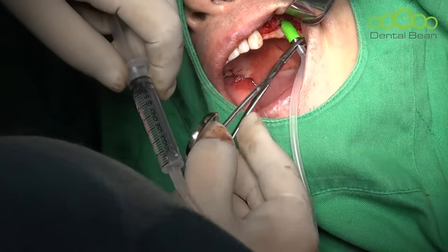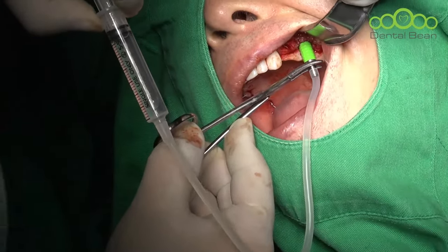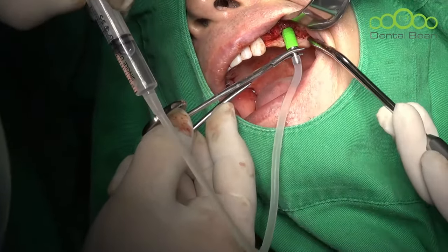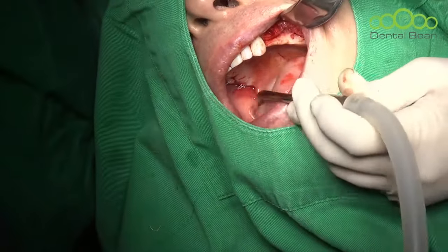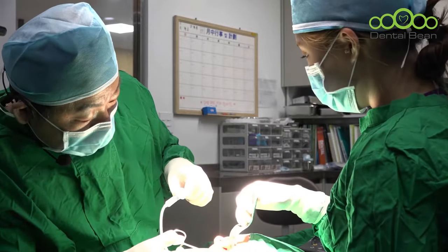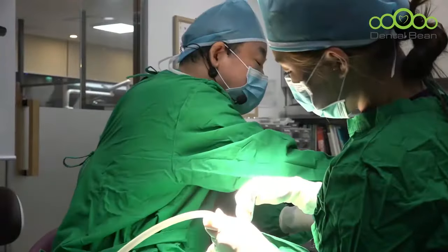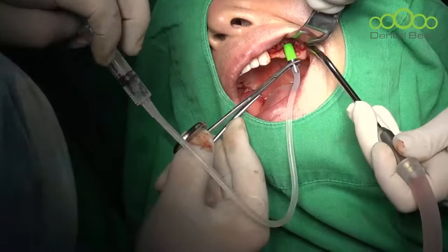Sealed. Okay. And then inject 0.5 cc. No sealing. Here. I'm sealed. Okay. It works. I will separate the membrane widely. Okay. Well done. I think it's well done. Membrane separated well through hydrolifting.